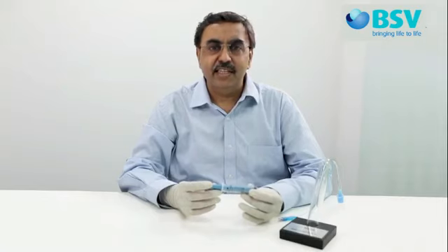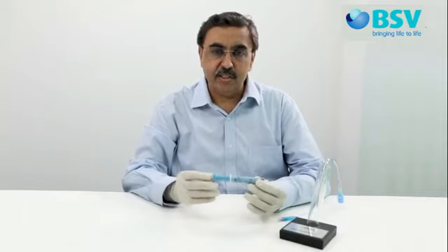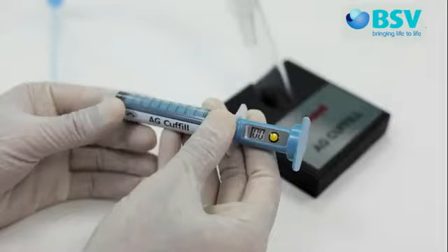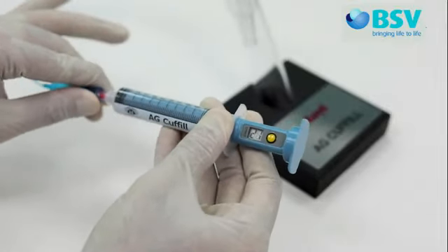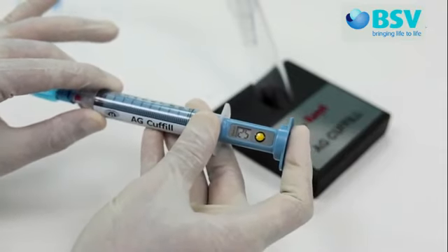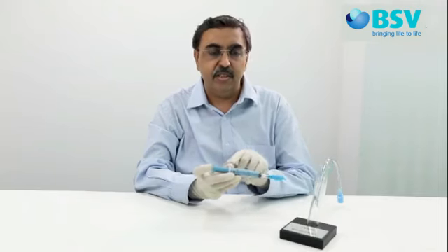To measure or check the ET cuff pressure in intubated patients, switch on AG Cuffil. Ensure the plunger is fully pressed down and there is minimal dead space inside the barrel. Connect AG Cuffil to the pilot tube. You can check the ET cuff pressure as displayed on the LCD screen. Hold the plunger lightly so that pressure from the ET cuff does not push back the plunger, giving a false reading.